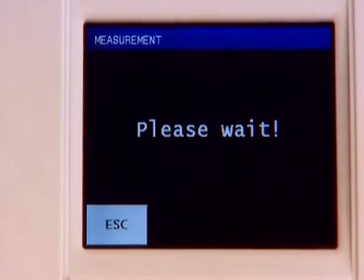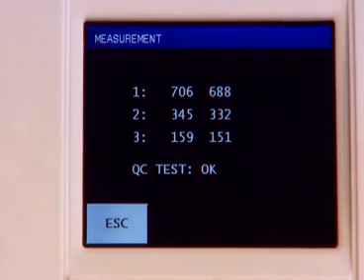Automatic calibration and checks of the LoRa smart reader are carried out after every power-up. The system checks of the optical parts are carried out by measuring control strips and the evaluation is then printed.